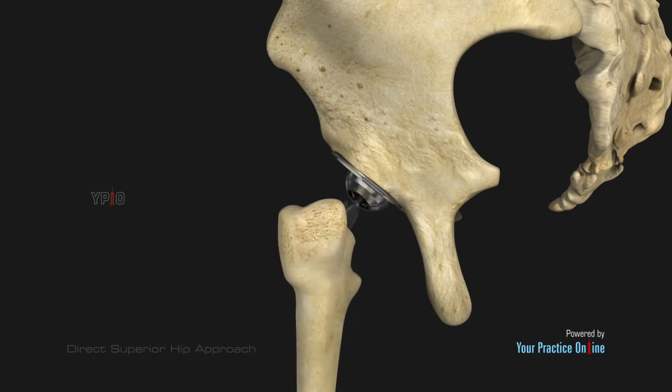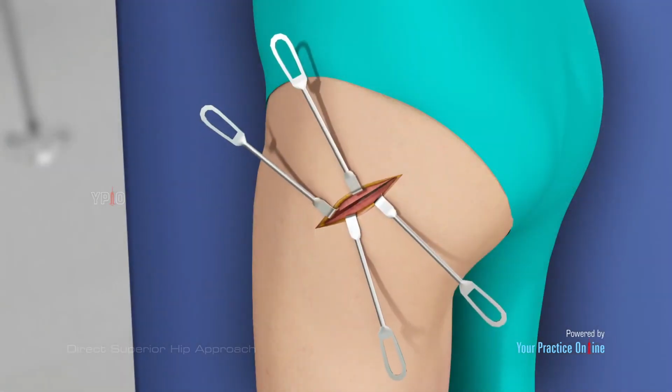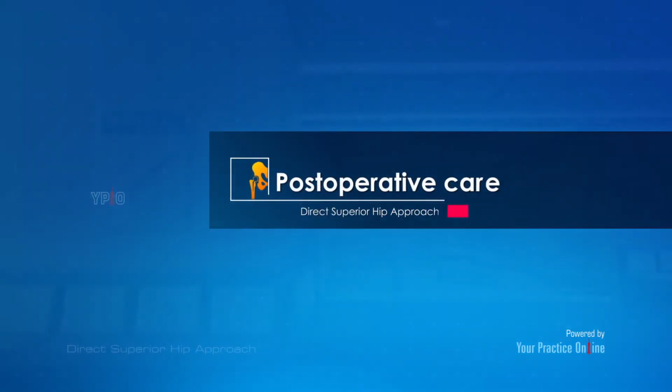The hip capsule, along with any other detached structures, are then anatomically repaired, thus increasing mechanical stability and proprioception of the hip. The incision is then closed with sutures. Avoiding injury to the muscles and other soft tissues reduces postoperative pain, allows a faster recovery, and ensures good hip stability. Post-operative care. You will be advised on follow-up care and activity limitations to minimize complications.